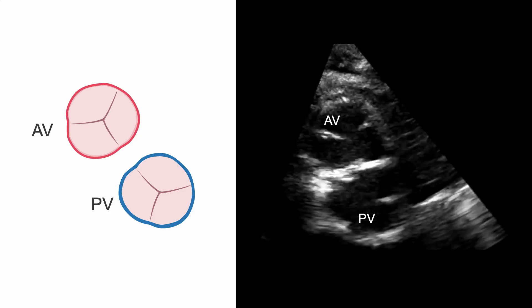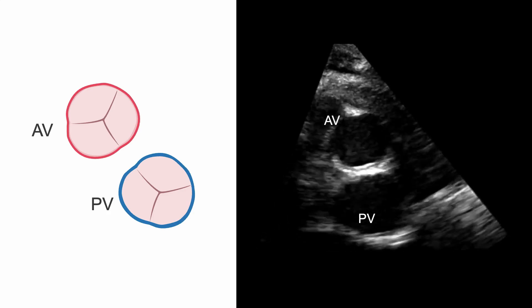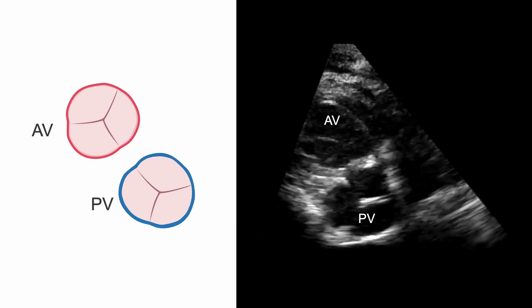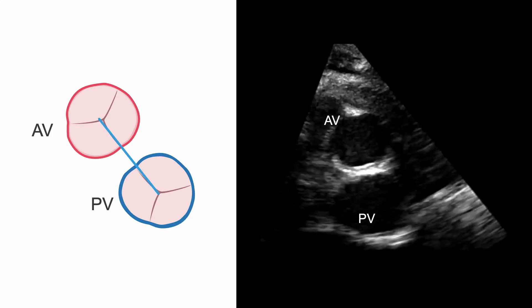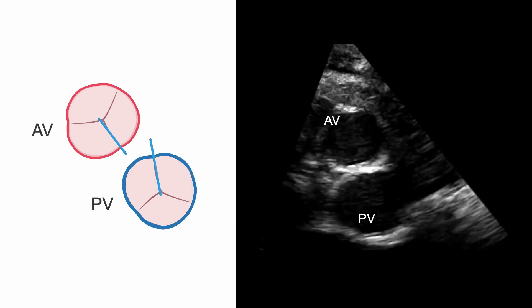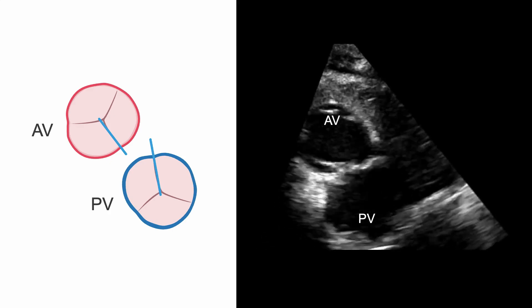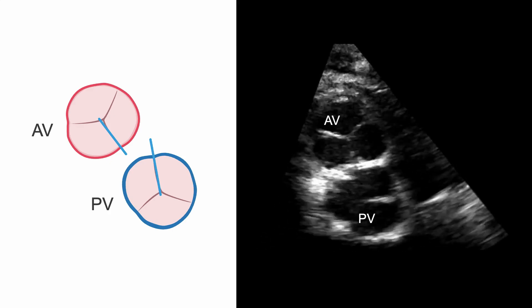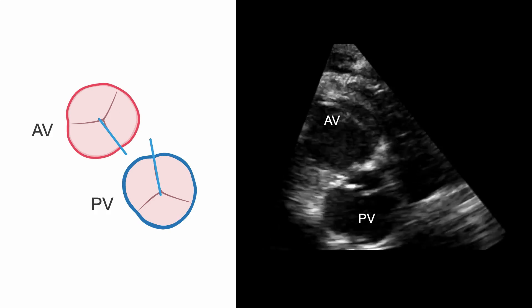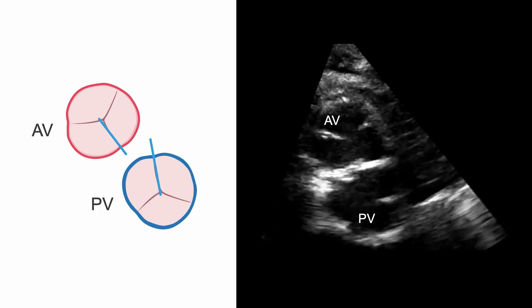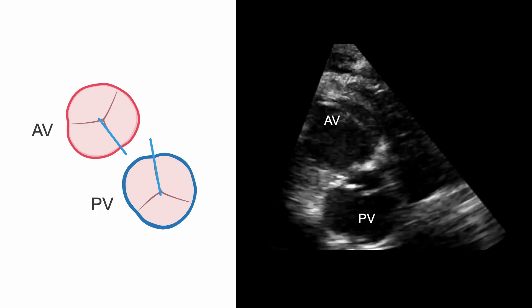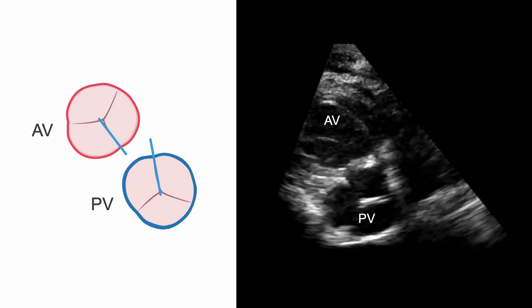The leaflets themselves should be in alignment. In other words, the valve commissures between the cusps should line up in the short axis plane. If the commissures do not line up, this is termed commissural malalignment, which may pose a greater challenge for the surgeon to re-implant the coronary arteries. This short axis imaging shows mild malalignment of the aortic and pulmonary valve commissures, and it may be helpful to slow down the image to view the commissures in better detail.